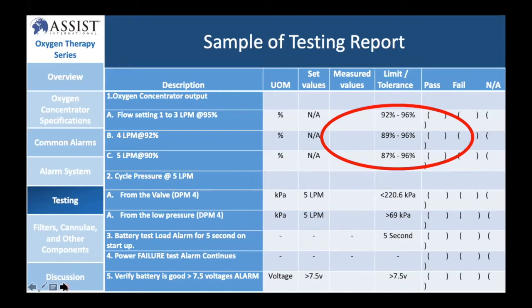The oxygen concentration is very important to measure for your device. We've seen numerous cases where the oxygen concentrators are working at less than 50–60% oxygen purity, but the assumption is that it's putting out oxygen that is the purity of 93% or higher. And the way you test for that is by using an oxygen analyzer.